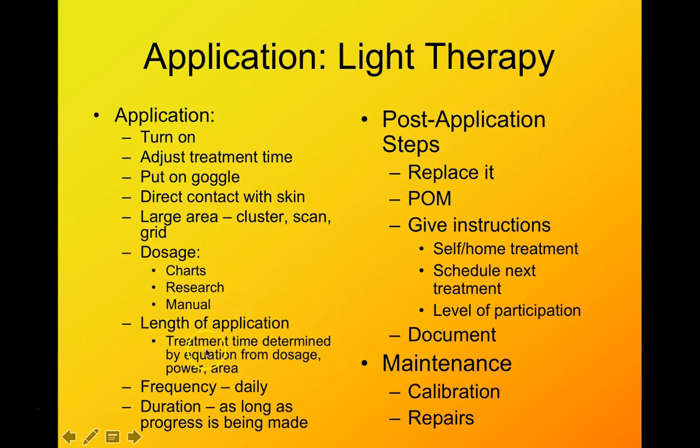Length of application, treatment time, is going to be determined from the equation that we talked about that is based on dosage and your area and the power that your light therapy can produce. So when we go over our machine, I'll show you those individual characteristics. You can do it potentially daily and as long as progress is being made.